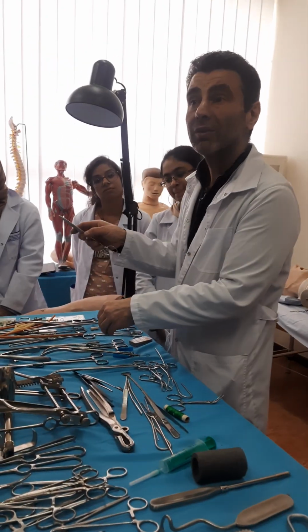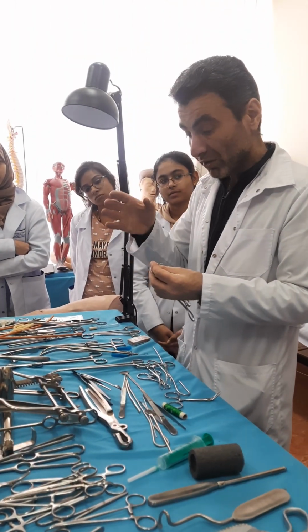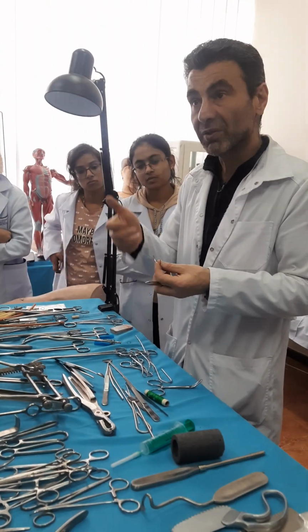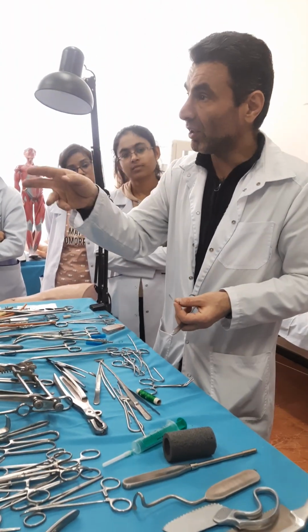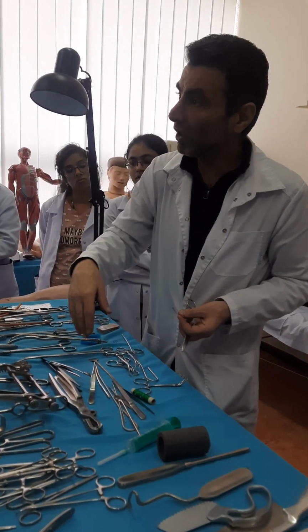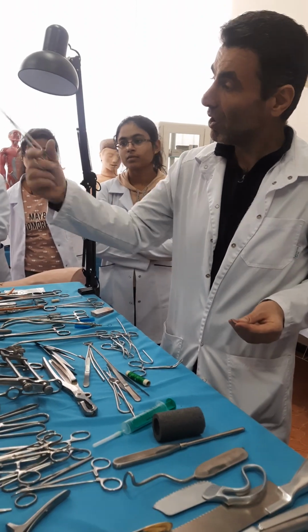Group number 5, the last group: connecting tissue. There are 2 groups of instruments here. By hand, for hand suturing: needles, needle holders, and we have several staplers. I think everybody sees the staplers. Metal wire is inserted into the margins, for example skin margins, lung margins, internal organ margins. But much more usually we use the hand suturing instruments.